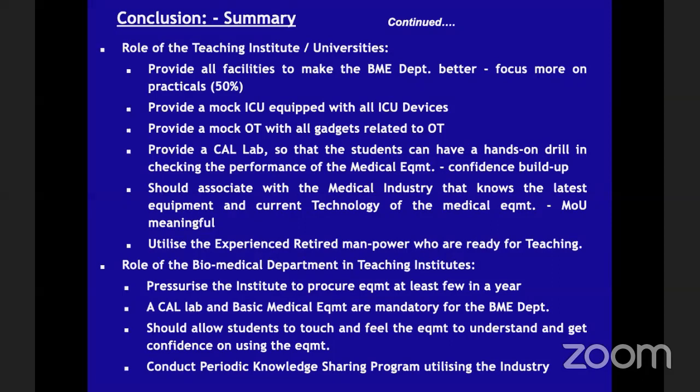So the teaching institutes should have an ICU-like environment. Use a refurbished machine, doesn't matter, but create it. You have an ICU bed, you have an infusion pump, you have a ventilator, a patient monitor, a suction apparatus, and a pulse oximeter. Create it, and maybe a patient mannequin on the bed, so the students who go inside can confidently touch any machine and check the performance of the machine, so that they get the confidence.